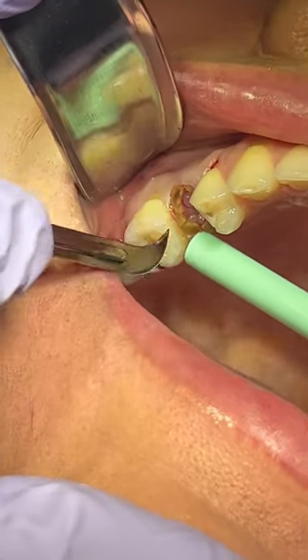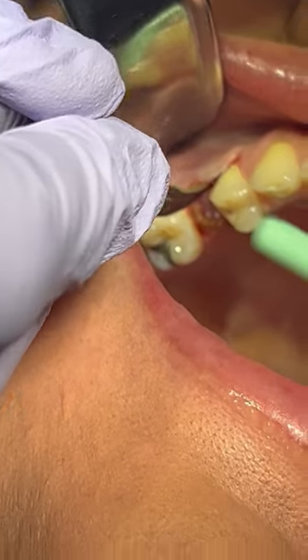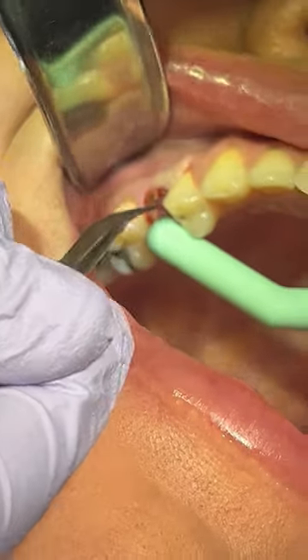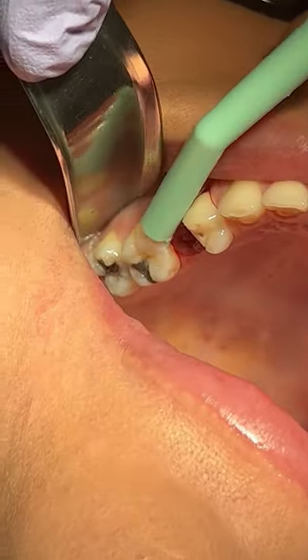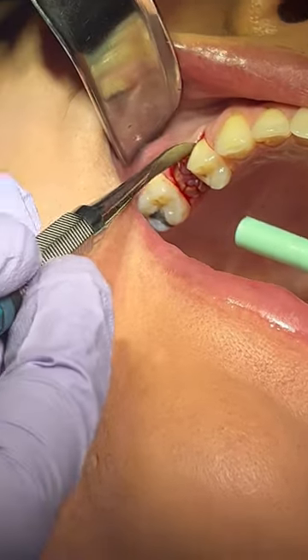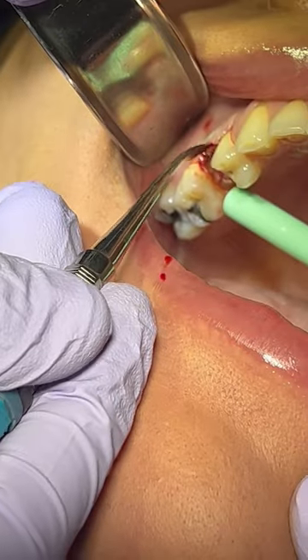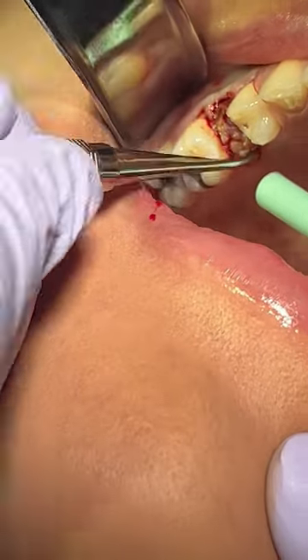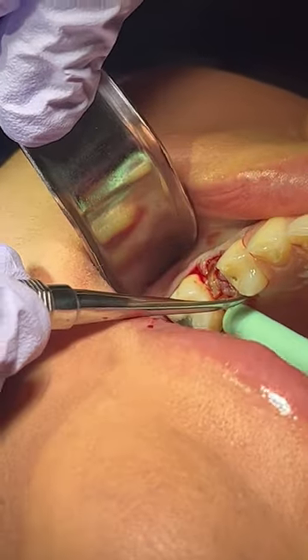First thing you want to do is make sure that you have adequate elevation. We're taking the 12B blade and going around, just getting into the papilla to release the papilla. Now we're taking the periosteal elevator and elevating properly. You want to elevate as much as possible so that later on we're going to be able to tuck in our membrane so it stays exactly where we want it. We're going to elevate on both the buccal and the lingual.